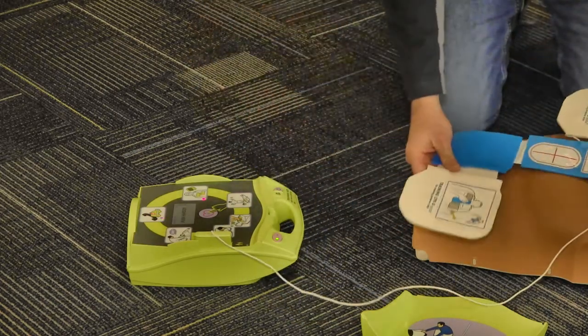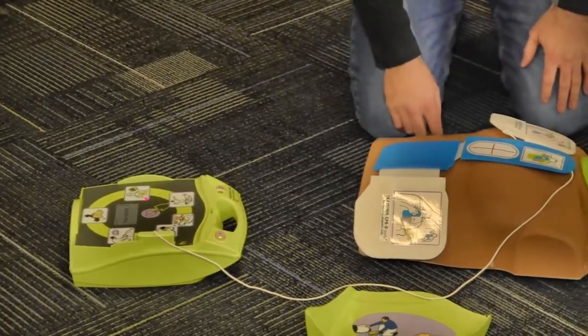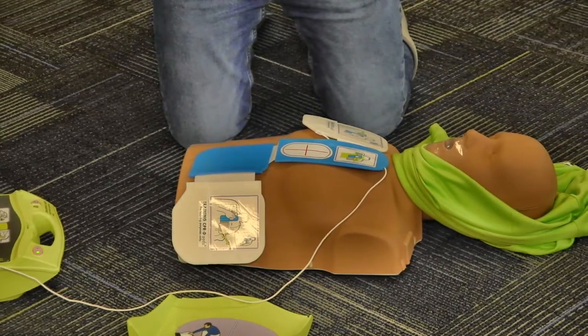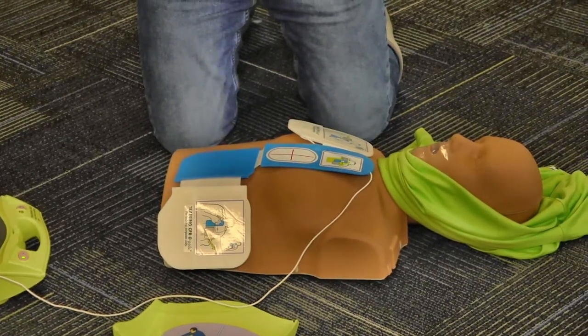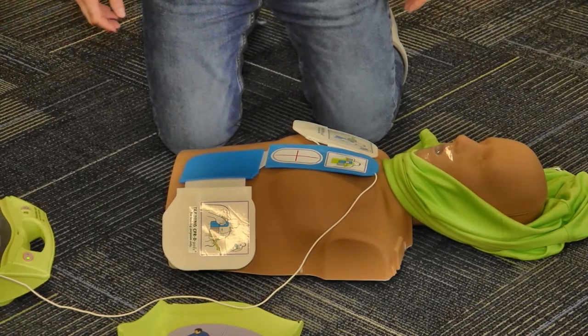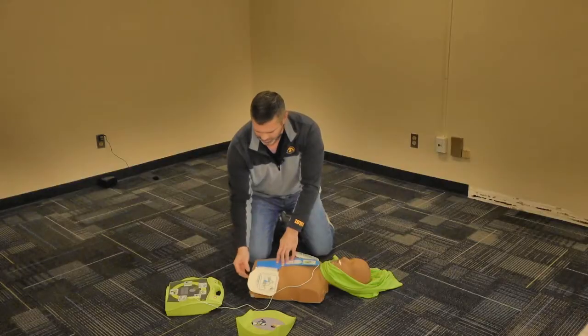We're going to attach these defibrillator pads to the bare chest wherever you are utilizing the compressions when you first start on the individual — that's where that red plus sign goes. So I was doing compressions right here in between the nipple line, so I'm going to put these pads right here in between the nipple line. And everything else just kind of falls into place.